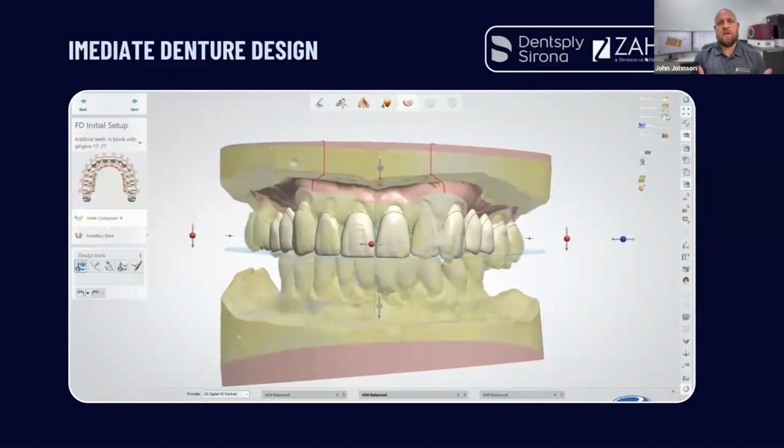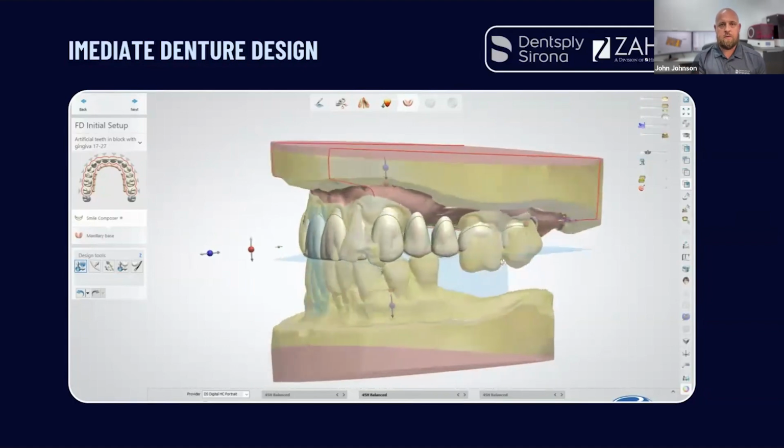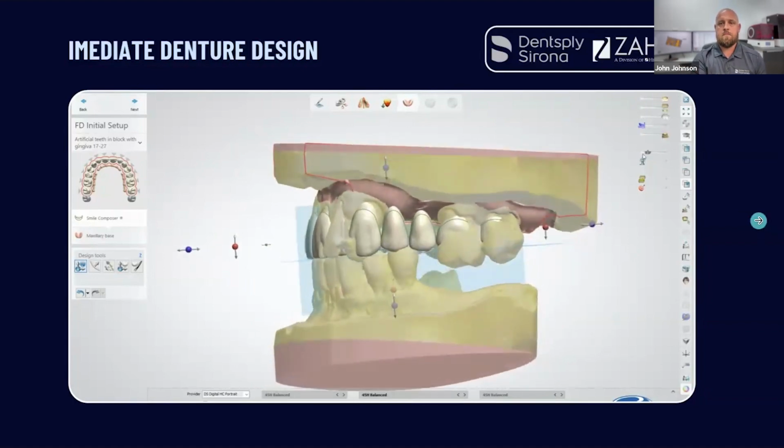And I have to communicate with my clinicians that if you give me an immediate denture, I'm going to try to follow as closely to what they have. Obviously we have to make some improvements, but if you don't want this cant, you have to communicate that with me. So it's just another great communication tool.